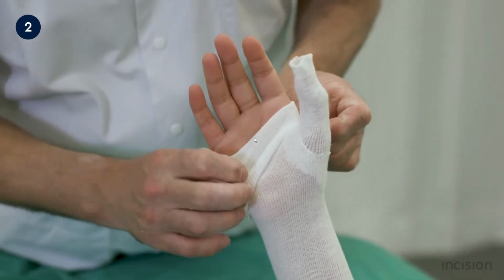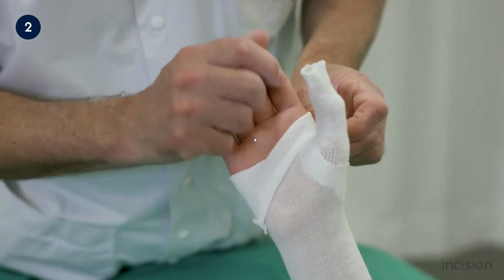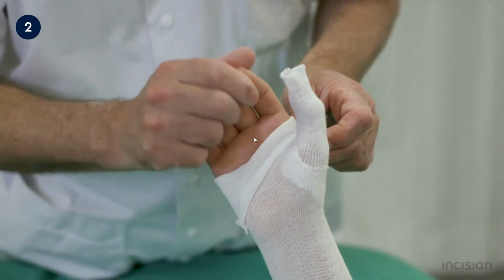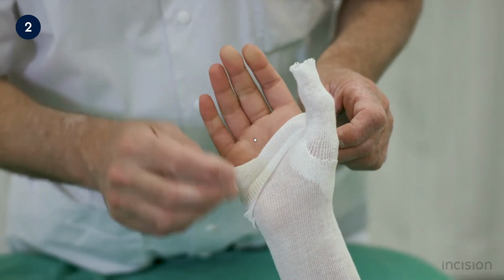Care should also be taken that the metacarpophalangeal joints of the 2nd to 5th ray are able to move freely after the splint has been applied. It is advised to take this into account during the application of the padding.